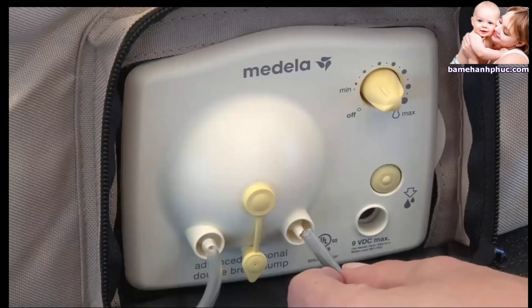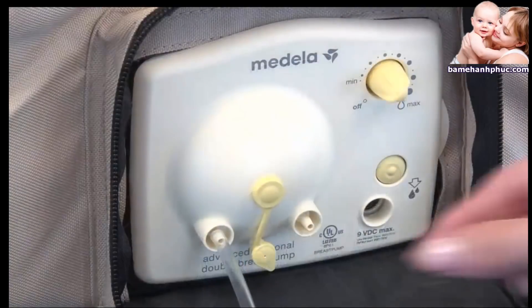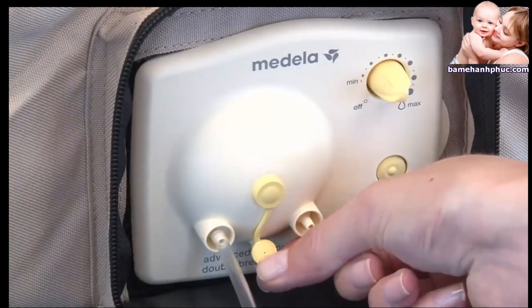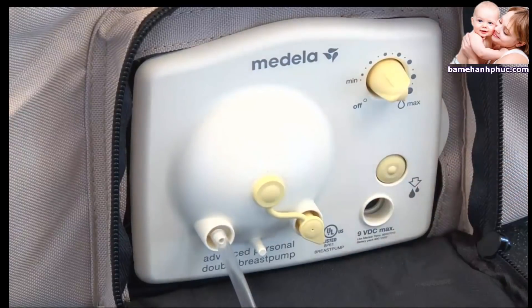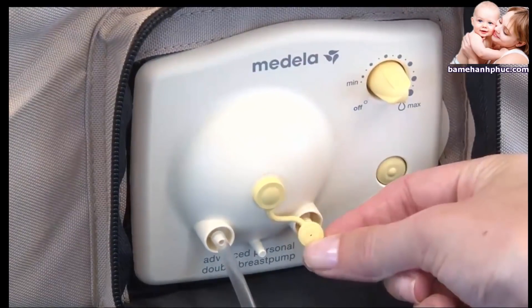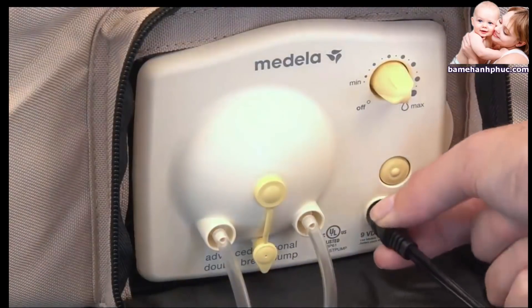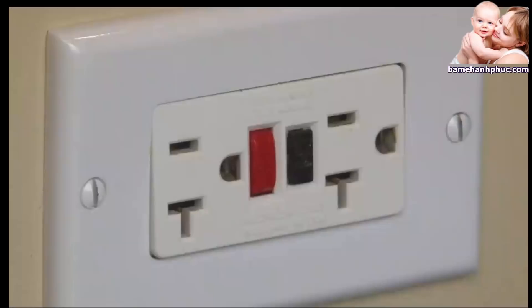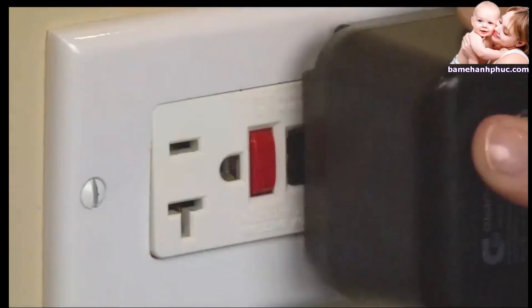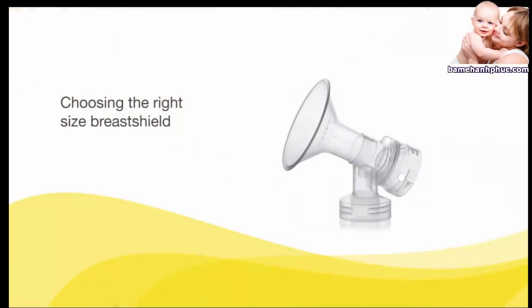Insert the other ends of the tubing into the ports on the face plate of the pump. If you are single pumping, place the port cap onto the unused port on the face plate. If you are double pumping, push the port cap onto the post at the bottom of the face plate. Plug the metal fitting on the end of the Medela power source into the power jack on the breast pump. When using the AC power adapter, plug it into a standard electrical outlet.